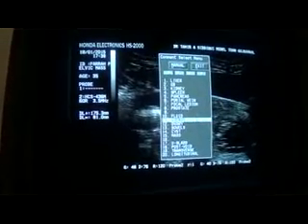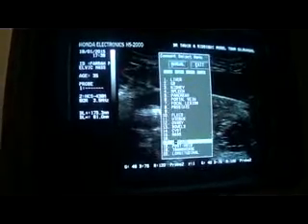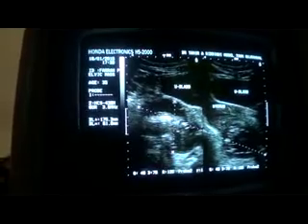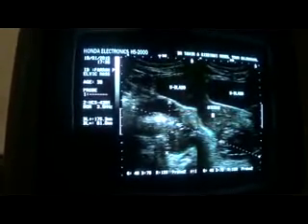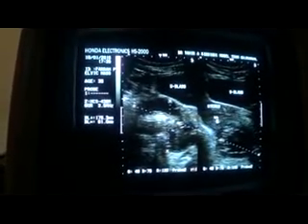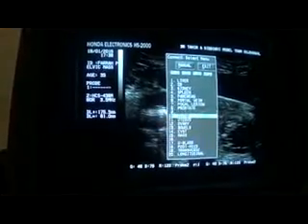However, any manipulation cannot be ruled out, because, as usual I say, I am not provided with any clinical history, I am not provided with any lab profile, and neither do I have any other imaging modality facility. However, the pregnancy test that I performed in my lab is negative, and you see this is the fluid component.